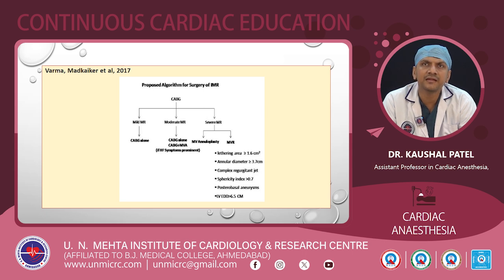But if the tenting area is greater than 1.6 square centimeters, annular diameter is greater than 37 millimeters, complex regurgitation jets are present, sphericity index is greater than 0.7, left ventricular end diastolic diameter is greater than 65 millimeters, left ventricular end systolic diameter is greater than 51 millimeters, and interpapillary distance is greater than 20 millimeters, then mitral valve replacement is advisable.